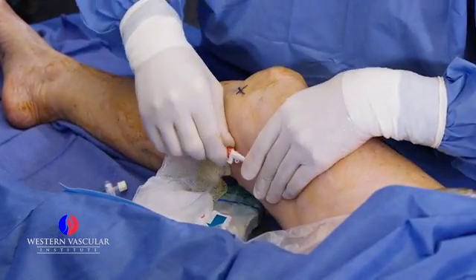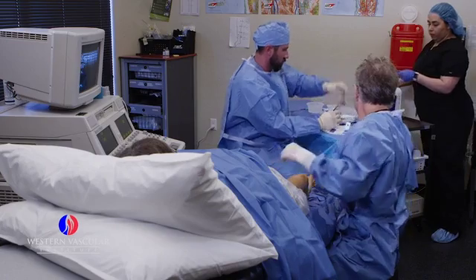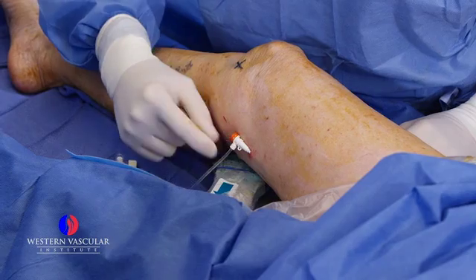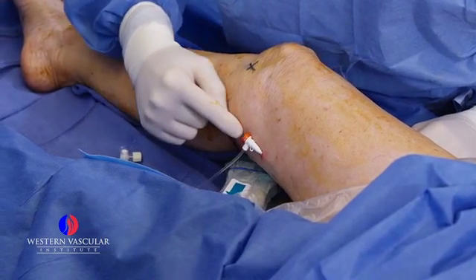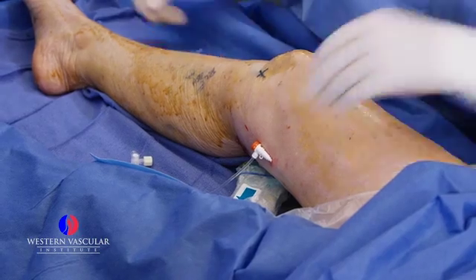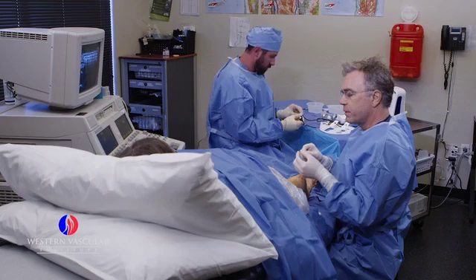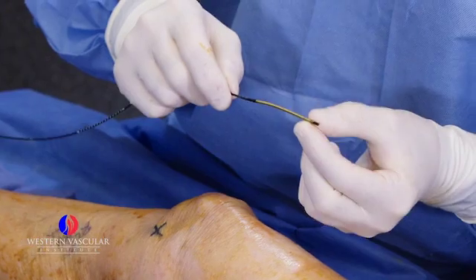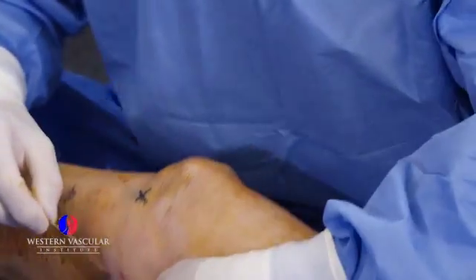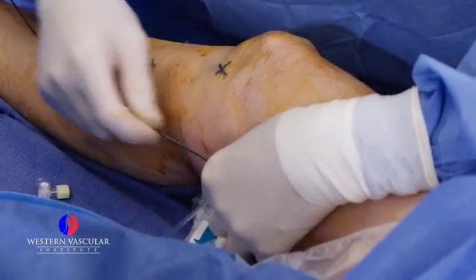You're going to feel just a little bit of pressure going into the vein there. We insert the radiofrequency catheter through this little valve, and it protects from any back bleeding into the area. This is the ablation catheter — this is the heating element here, which is the copper-colored material. We just insert it through the valve all the way up.